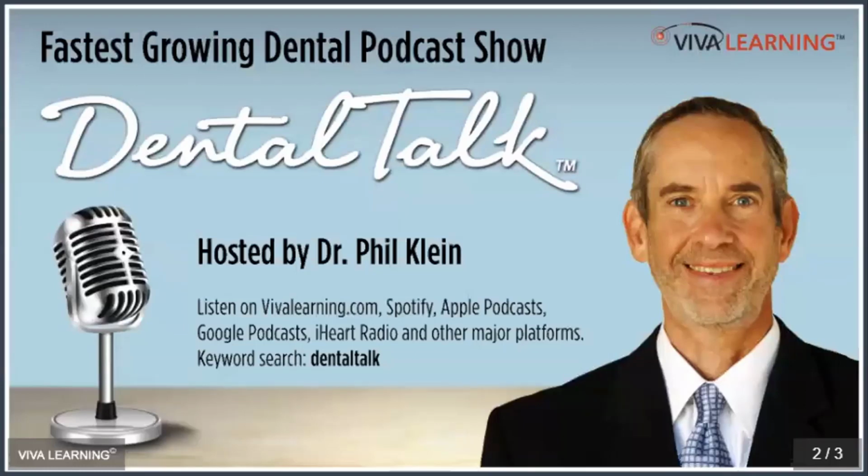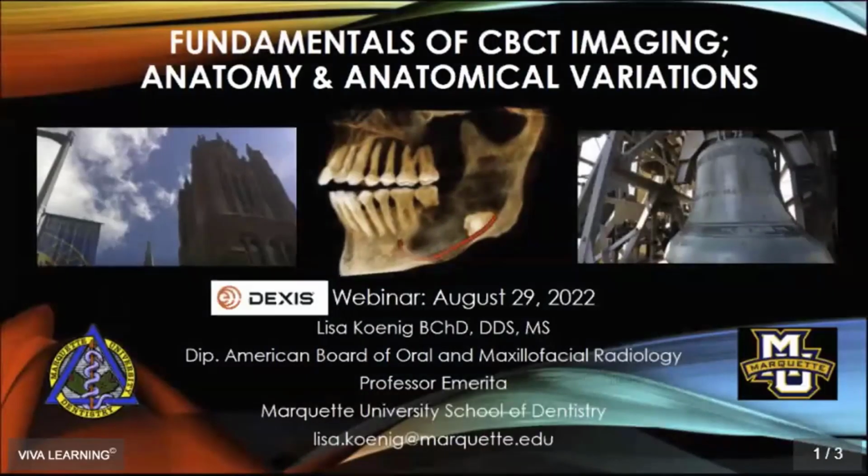Any guidance on airway space and CBCT? That, you know, I know I didn't get into airway. I mean, this was a very short, it was a lot of information to put into 45-50 minutes. And I potentially will be doing another webinar, maybe on temporomandibular joint. And that's when I usually address any airway issues. I am doing, I know for sure, another one more in depth on implant assessment and also on endodontic assessment. So we'll see.